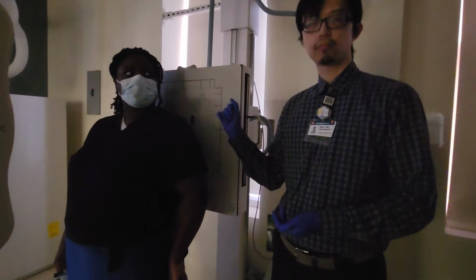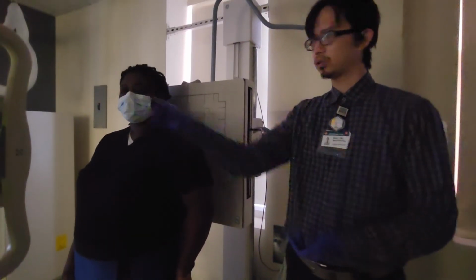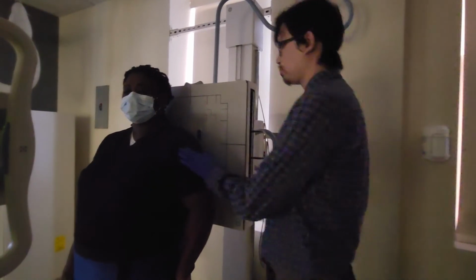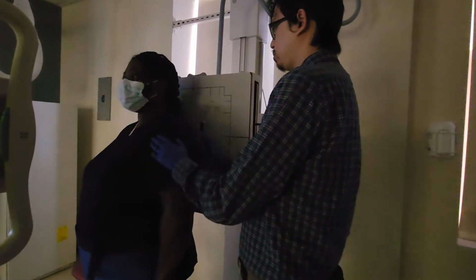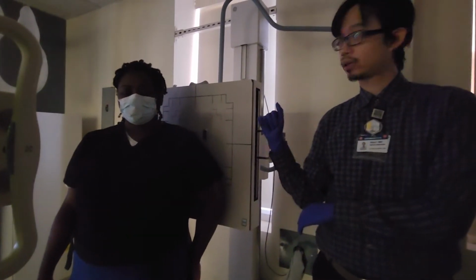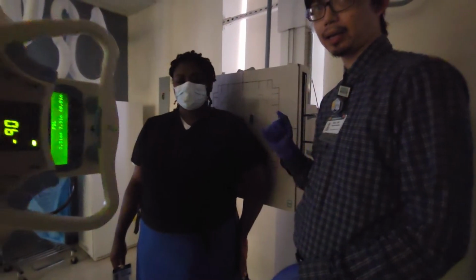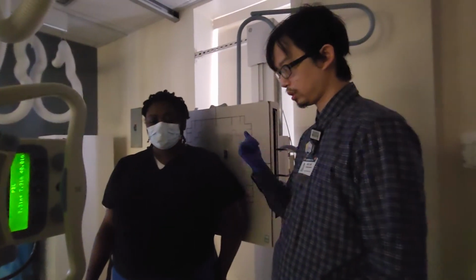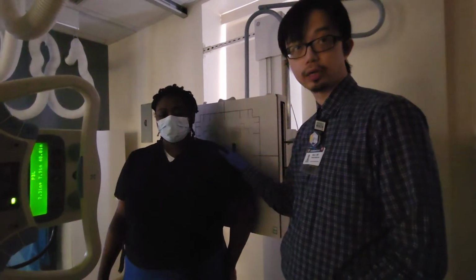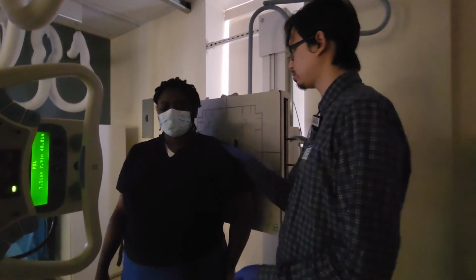LPO. That's right, we want an AP oblique, LPO, RPO. Why? Because the patient's already AP. I just need to turn them either this way, or the other way, and I can shoot my X-ray, right? Here's the problem. If I was doing an AP oblique for the shoulder here, I would need to do an RPO. So turn Shamika.